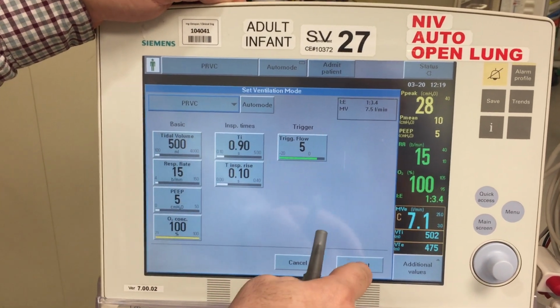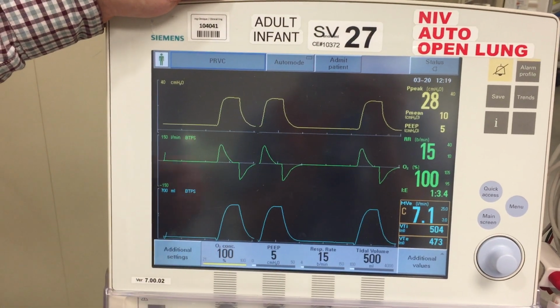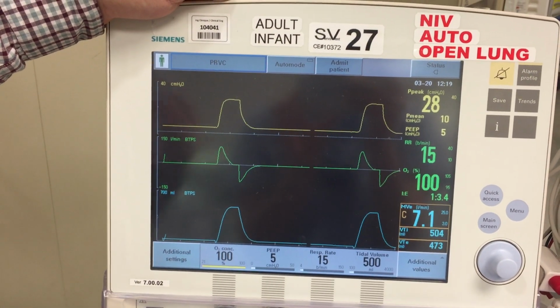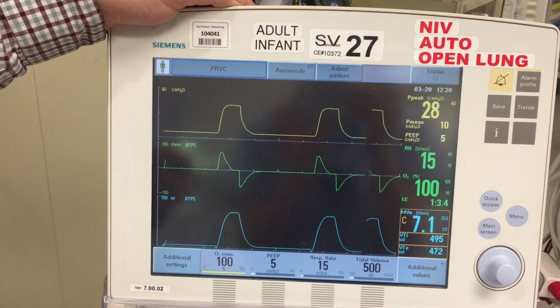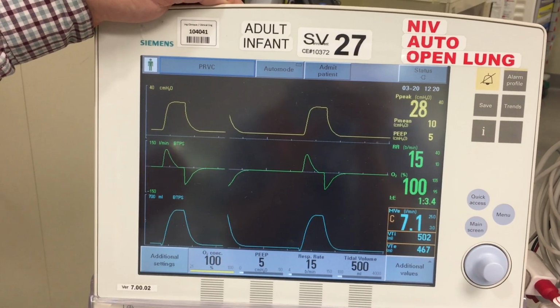Now, if you wanted to titrate your I time, there is some fine tuning that we can do according to our flow waveform. But again, I wouldn't consider that a critical thing to have to do in an emergency COVID situation.